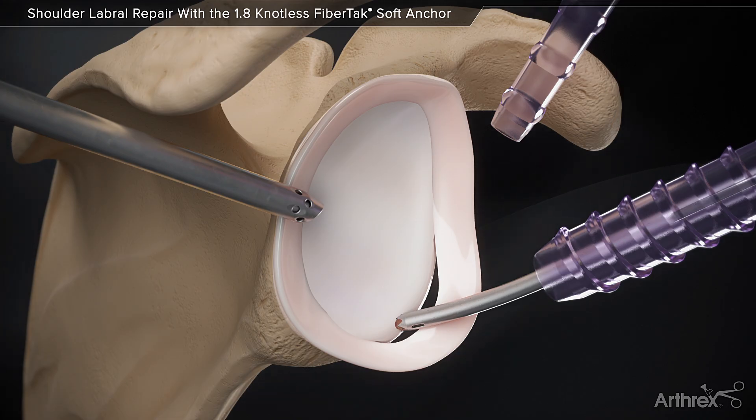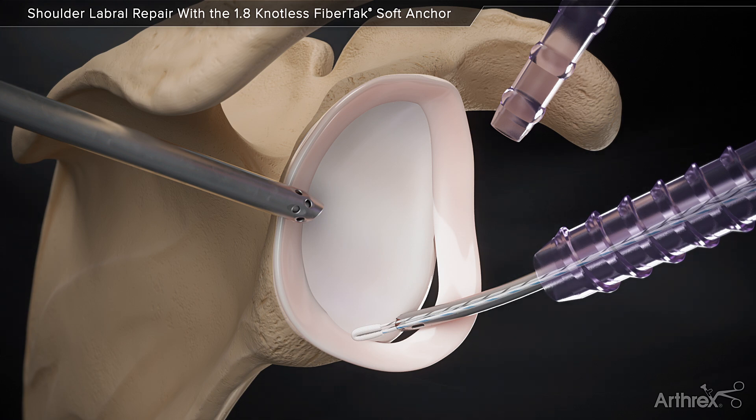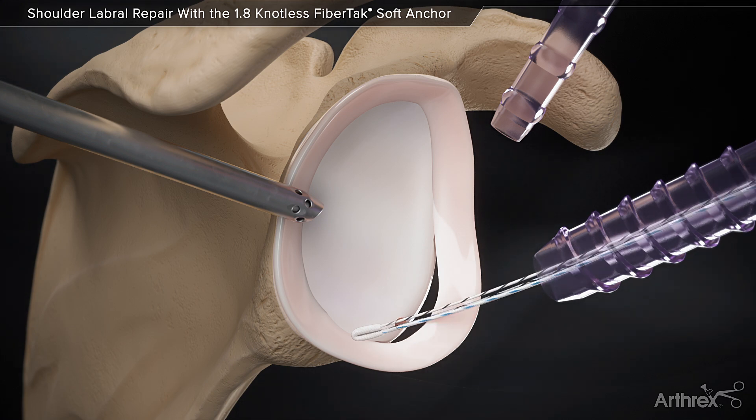Leaving the guide in place, the Knotless FibreTac Anchor is inserted and impacted until the handle is flush with the guide. Remove the handle and drill guide, leaving the No. 2 Repair Suture and 2.0 Shuttling Suture.